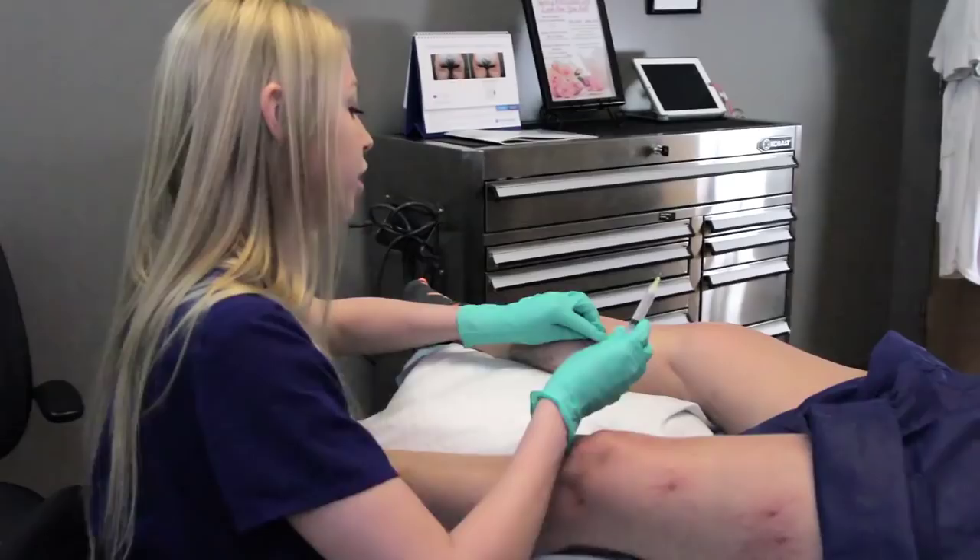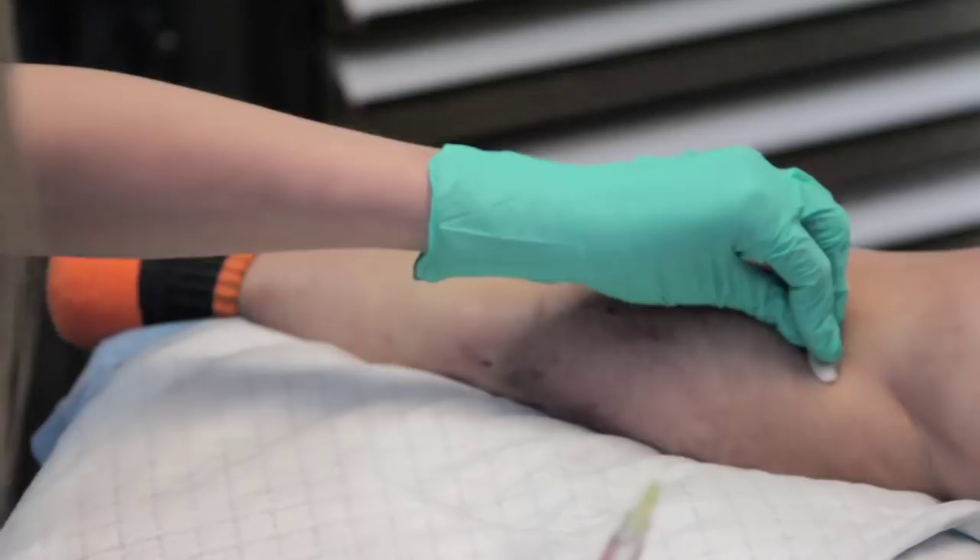You can see here the areas that we have treated just look a little bit red, a little bit raised, and that's exactly what we're looking for.